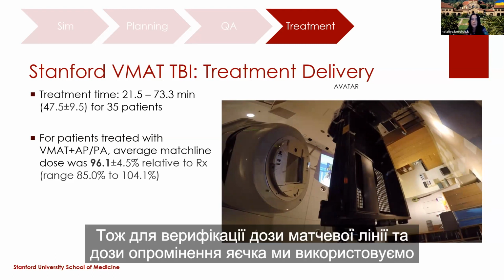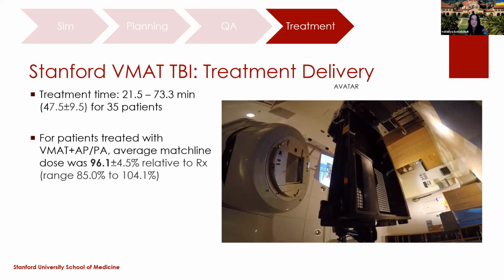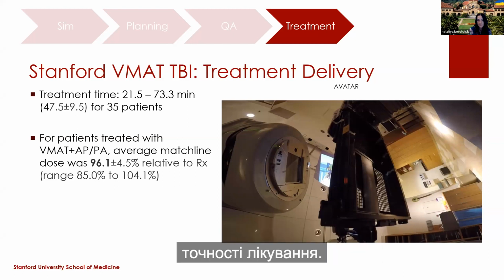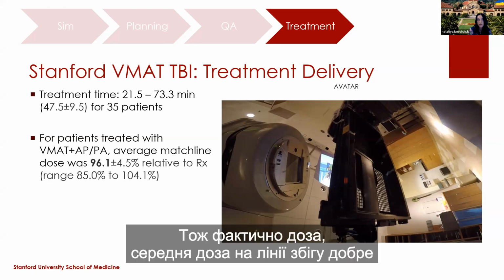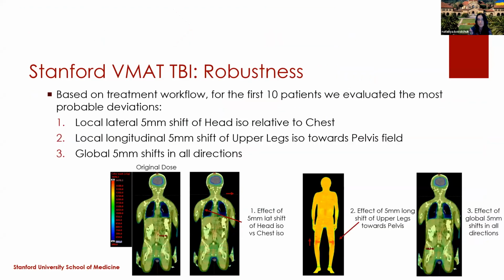So for matchline dose verification and testis dose verification, we use nanoDots or OSLDs. We place them on the skin, on the match line, to verify the accurate match line and accurate treatment. The average match line dose matched well the planning dose.